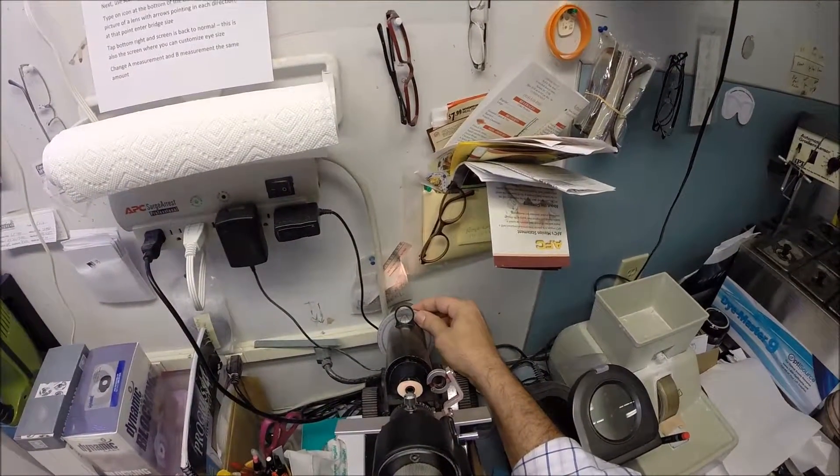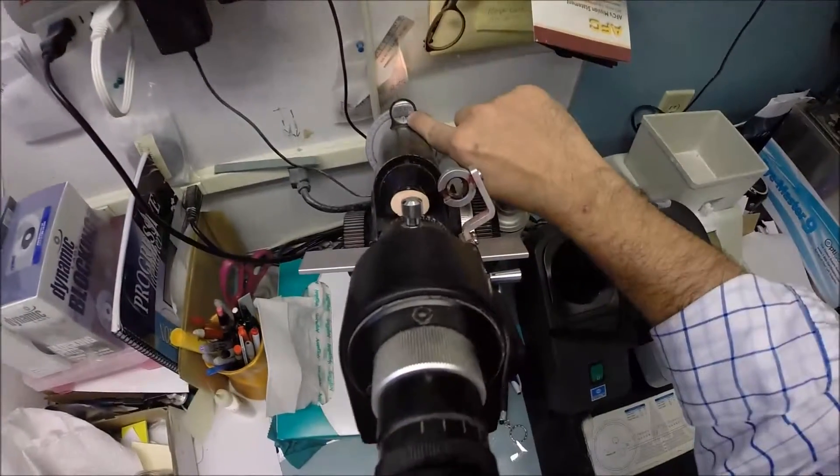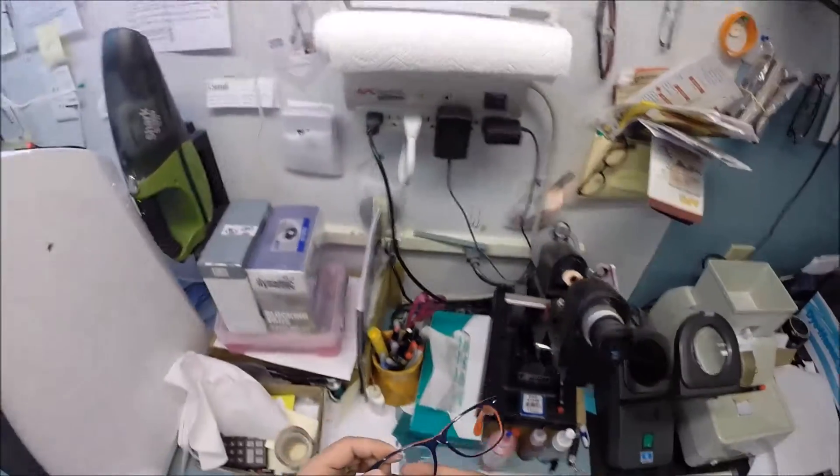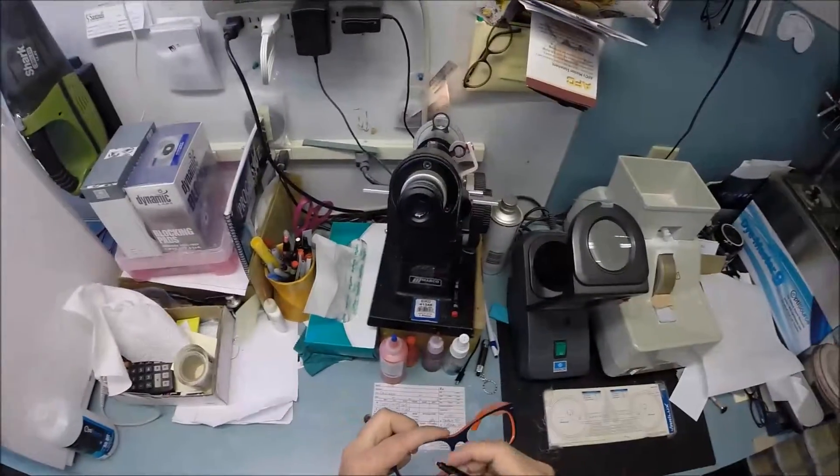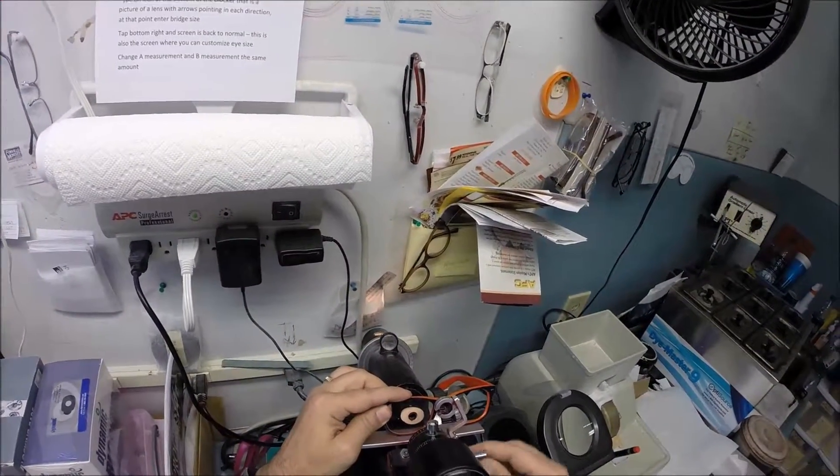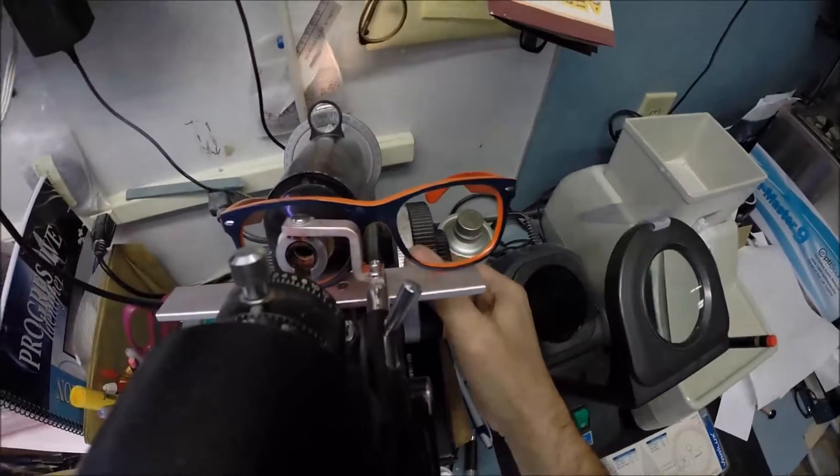While that is cutting, I want to inspect the right lens. I'm going to spin the axis wheel back to 165, exactly halfway between 160 and 170. I'm going to put the lens in right above that red dot. Let me darken that red dot for you.